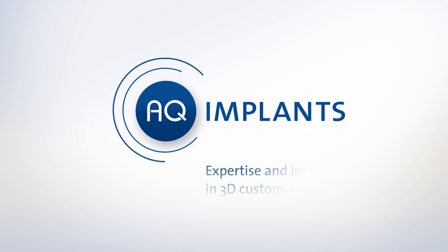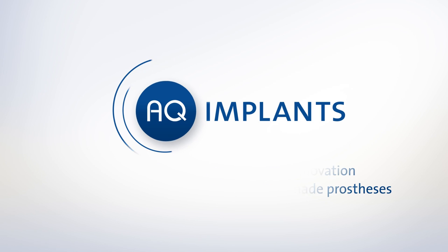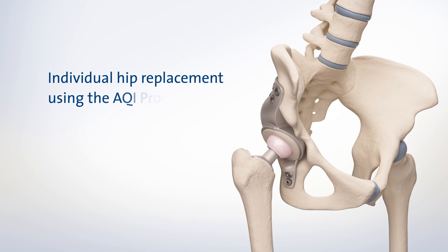AQ Implants: expertise and innovation in 3D custom-made prostheses. Individual hip replacement using the AQI process.